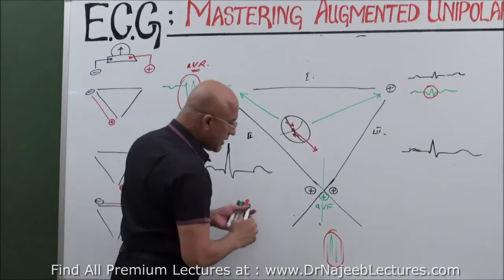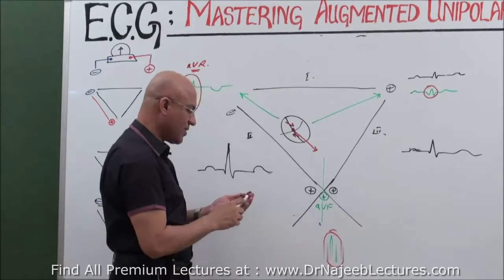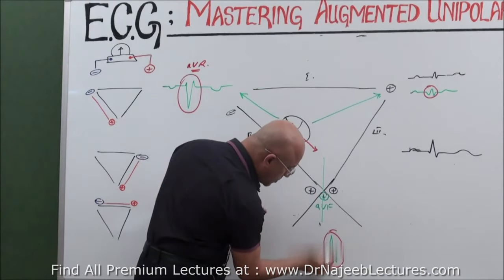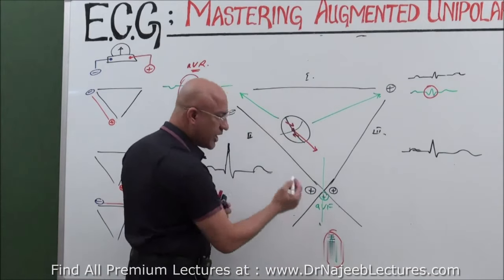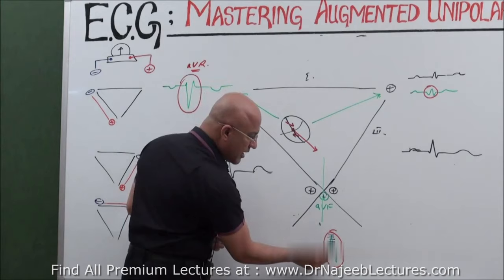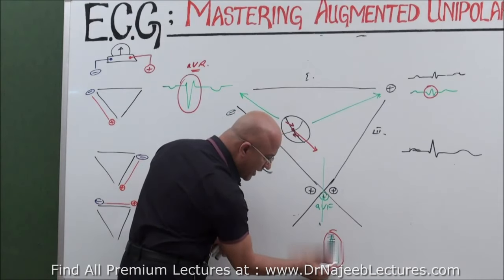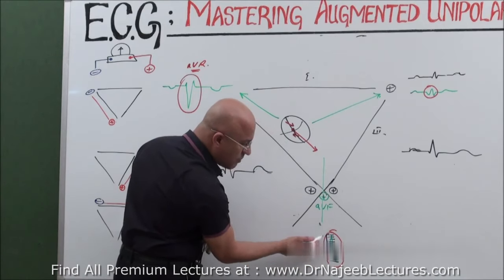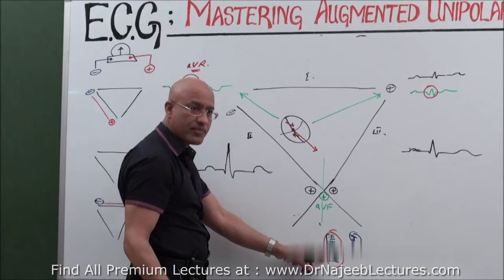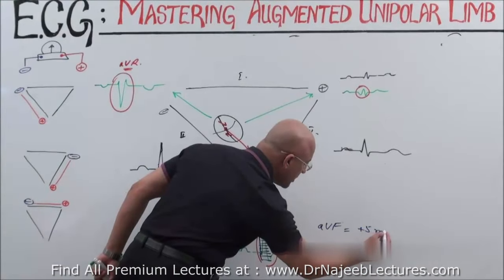Now imagine, if you measure the height of this, and also measure the height of this and add together. For example, we are just taking an example. Let's suppose it is 8 millivolts high. I'm just talking about the QRS complex. Actually, from 8 we should subtract this, but for a while I just take R. So up is 8 and below is 3. So net is 5, positive 5. You understand from where it came? Is it clear? Yes. So we can say AVF voltage is supposed to be plus 5 millivolts. Is that right?